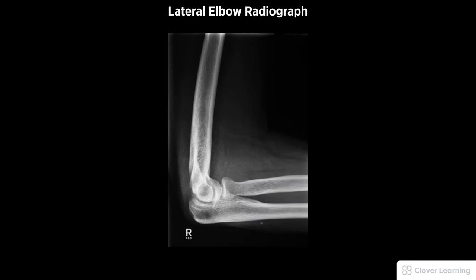A diagnostic lateral elbow radiograph must be free of motion and rotation, with the elbow flexed 90 degrees. Demonstrated anatomy to include the superimposed humeral epicondyles with proper visualization of soft tissue and bony detail.